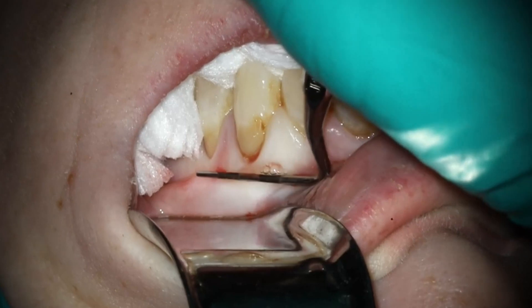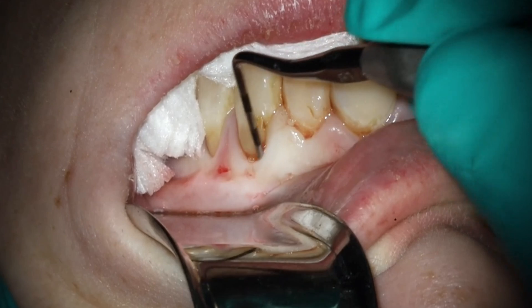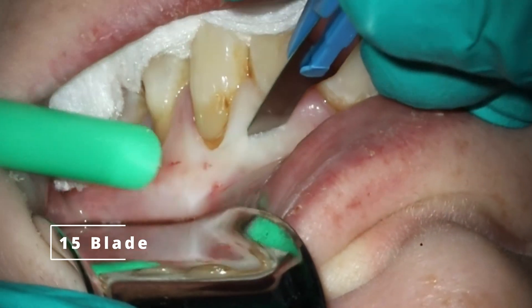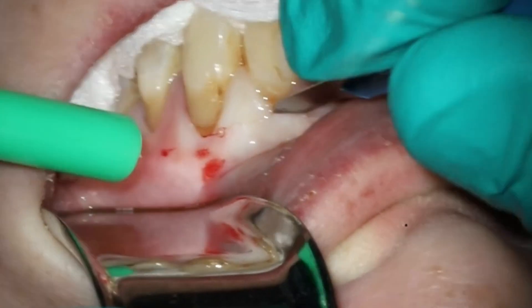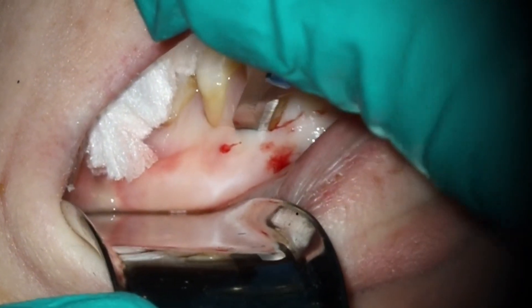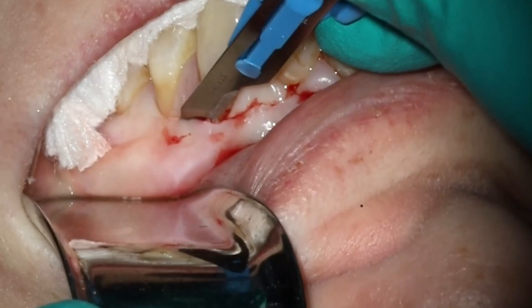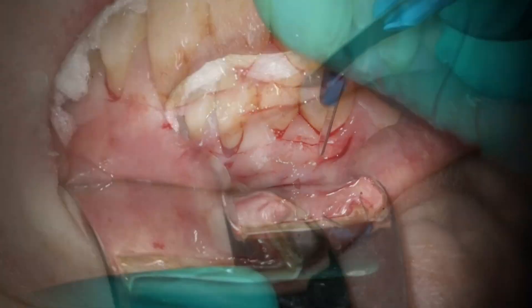You can see she already has a fair amount of recession unfortunately. Thick biotype but a weird pattern of recession, and there's going to be some significant bone loss on this. This is one where I ended up having to send her to a periodontist after we saw her back because I was a little concerned about her healing. Because of that I decided to do a papillary sparing incision rather than an attached gingival incision like I normally do, just because of the lack of pocket depth and the lack of attached gingiva.